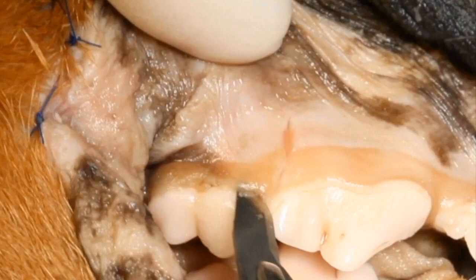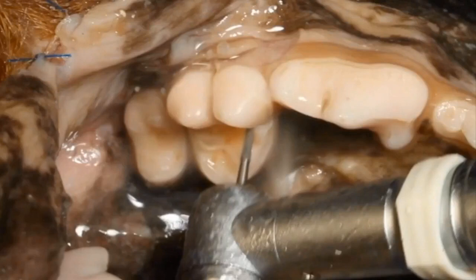With the maxillary first molar, we always do a vertical releasing incision, so it's not quite crowns facing us as much as the others, but you can see it makes sense and we've got really good exposure. The crowns are facing us somewhat but pointing down a little. When we section that three-rooted tooth, the crowns are definitely facing us because we need to see where we place the cross-cut tapered fissure burr. We make two passes — one cut and then a pass between the two vestibular roots to section it.